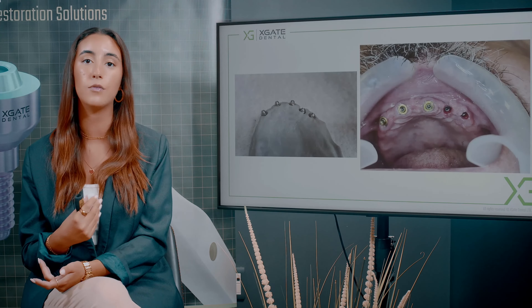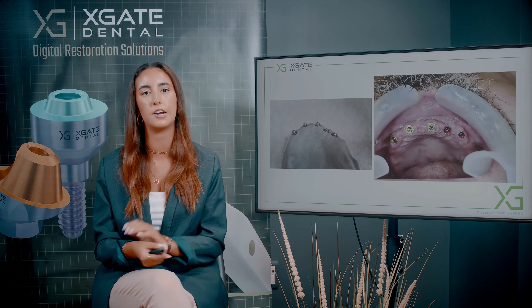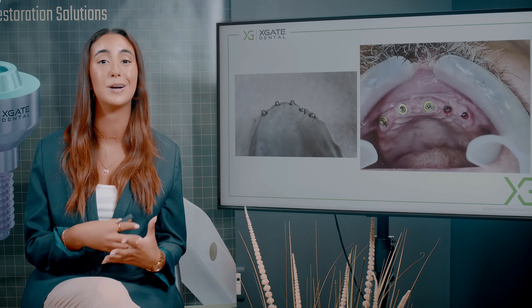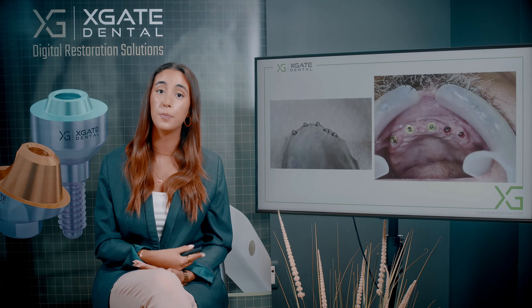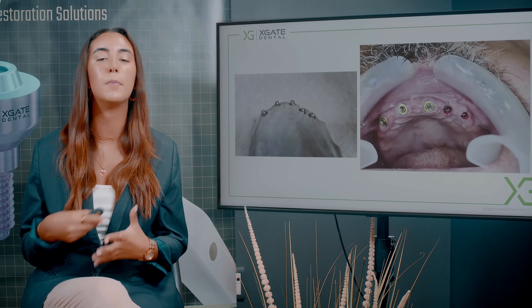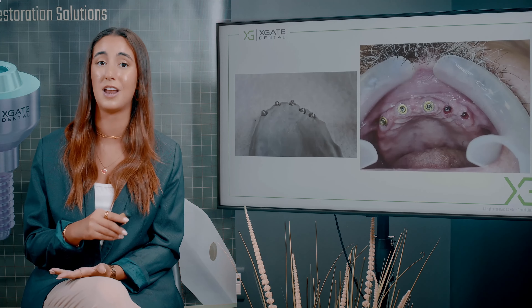The cone here is about 2.5 millimeters high, whereas here you have 0.8 millimeters, which also allows for more surface area. You have much more area for the screw and can make the pillar of the bar much thinner. The thinner the pillar, the fewer problems you have in the aesthetic regions. The screw will be much closer to the horizontal part of the multi-unit, and the height of the pillar doesn't have to be as great.